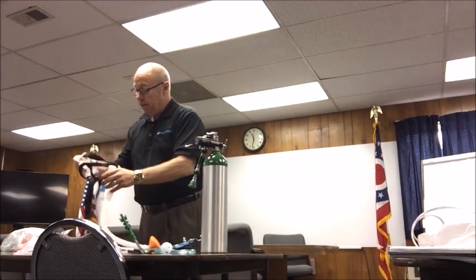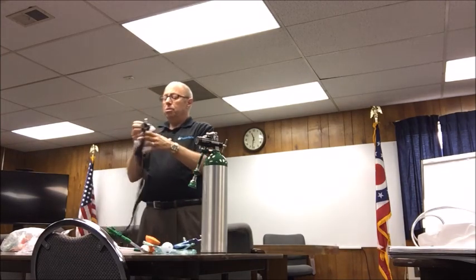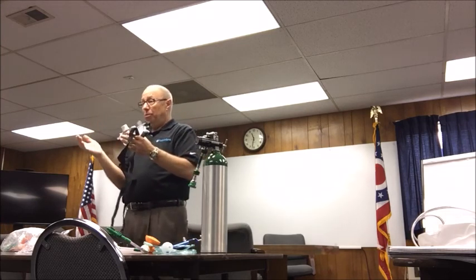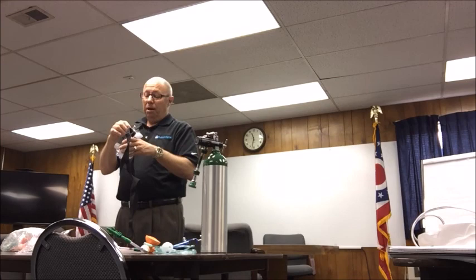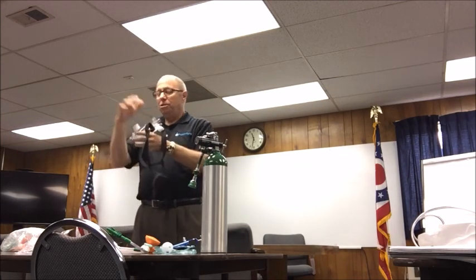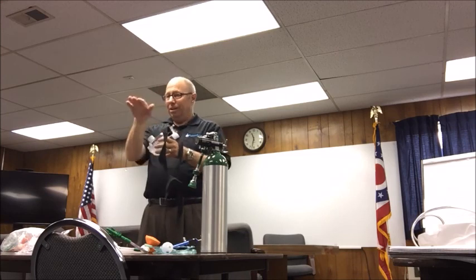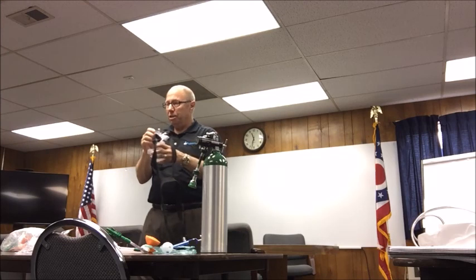One of the areas, quite honestly, and this is an older mask, is kind of, I don't want to say an Achilles heel, but every once in a while we'll get a mask breakage right here. Remember, these are hospital grade masks. They're really made to sit in bins in the ICU, CCU. And in EMS, we like to put 10 pounds of you-know-what in a 5-pound bag. We like to cram bags. So if you cram a D cylinder on it or whatever, this may break. All you have to do is call Emily, and I'll take care of the mask. We'll fix it.